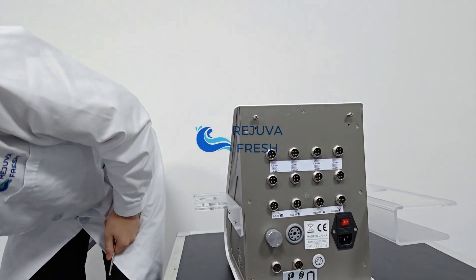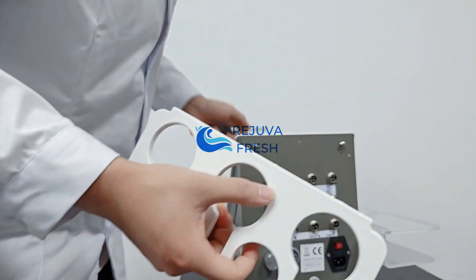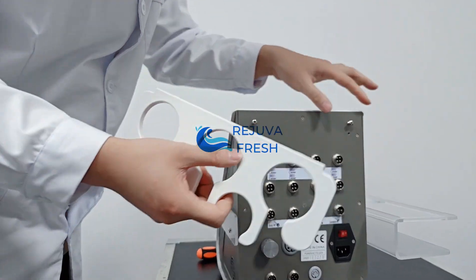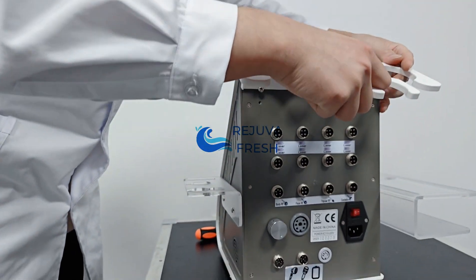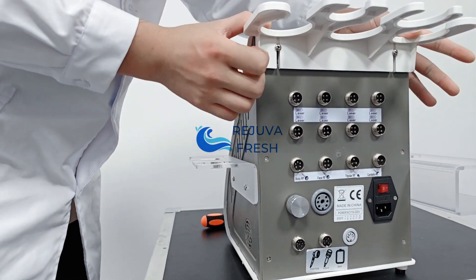The final holding part is for the cavitation handles. You can see the screws and there are two slots here. Connect the holding part like this.